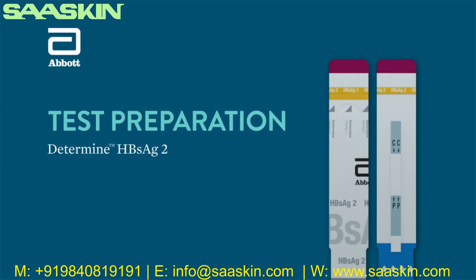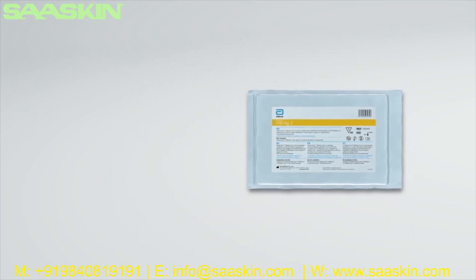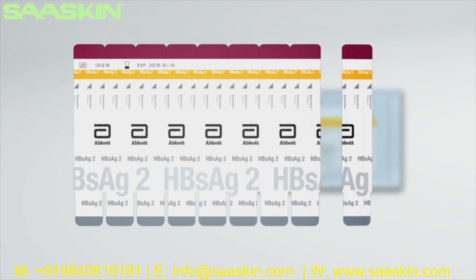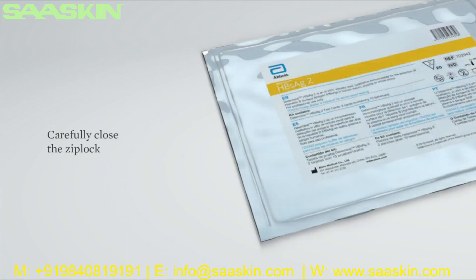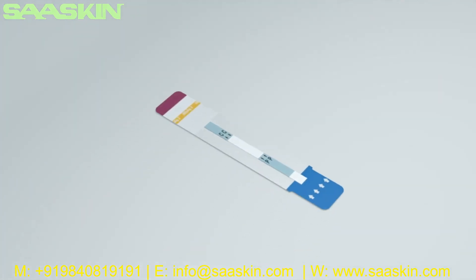Test Preparation: Open the aluminum Ziploc pouch containing the Determine HBsAg2 test cards. Remove the desired number of test units from the 10 test unit card by bending and tearing at the perforation. Removal of the test units should start from the right side of the card to preserve the lot number, which appears on the left side. Store unused cards and test units only in the aluminum pouch containing the desiccant package. Carefully close the Ziploc so that the cards are not exposed to ambient humidity. Remove the protective foil cover from each test unit and lay the test unit flat. The test should be initiated within 2 hours after removing the foil cover. Do not touch the sample pad.